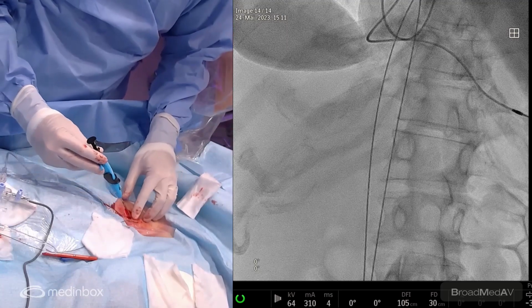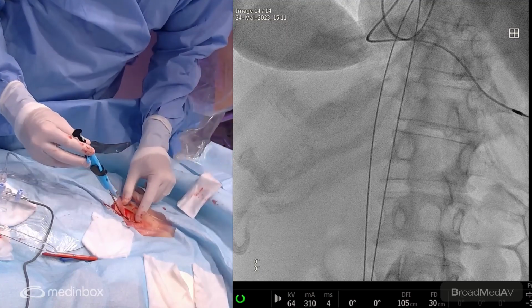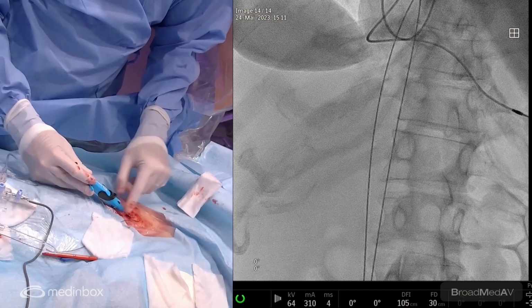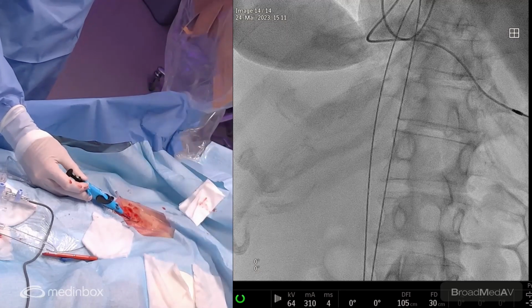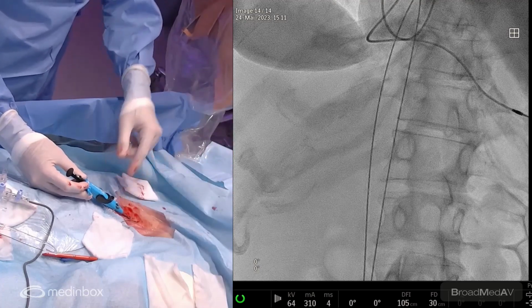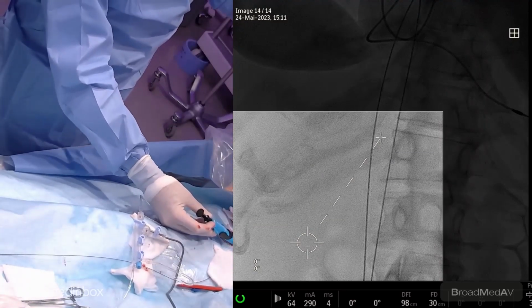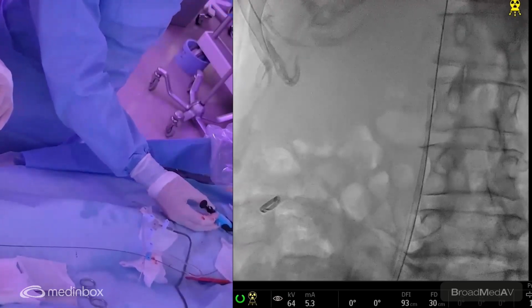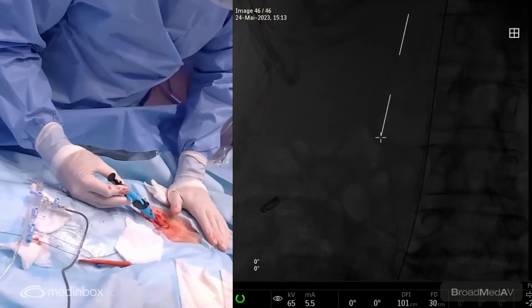Okay, let's just see here on the groin. If there is any doubt, we can potentially recuperate the vein, put the introducer back and close at the end. You want to close at the end? Maybe, because I think the preclose is not going. Okay, let's close at the end. The patient is very thin here. I just want to see the trajectory of the preclose. It's fine. Well, maybe I think we can preclose it. Okay, let's preclose.